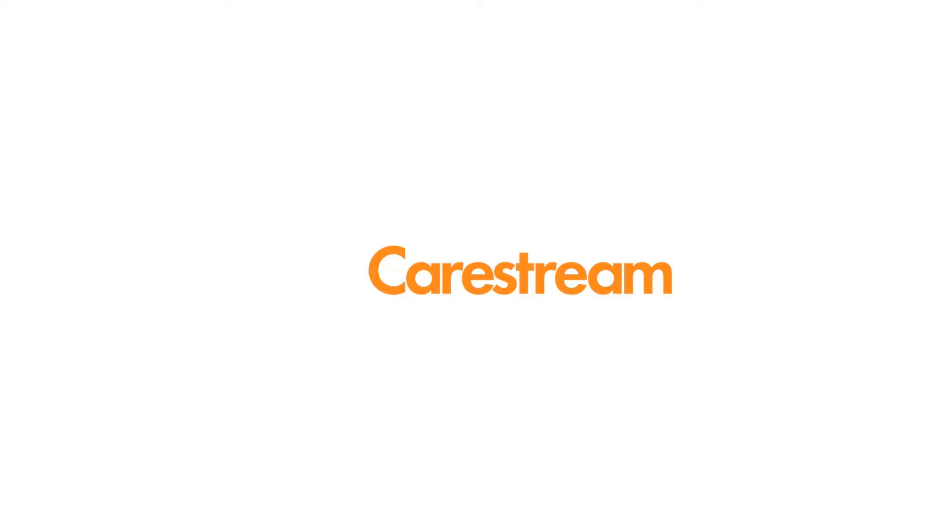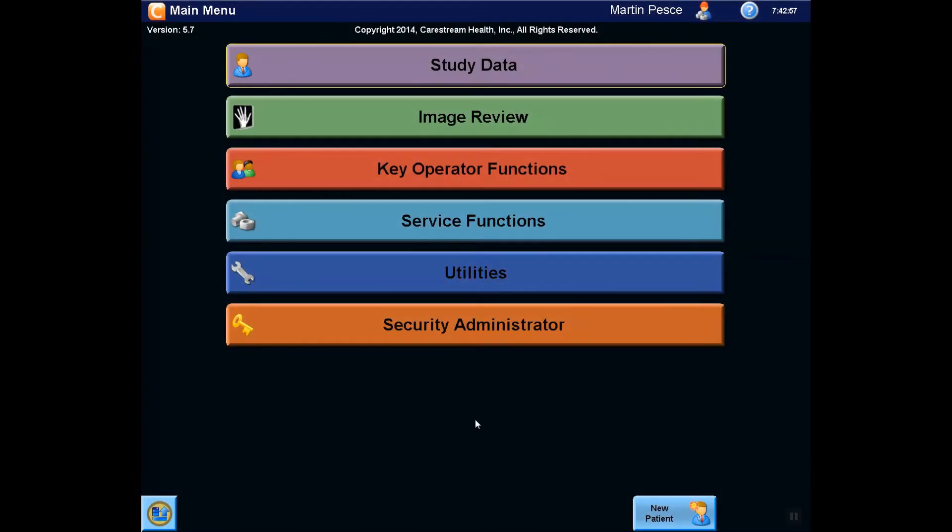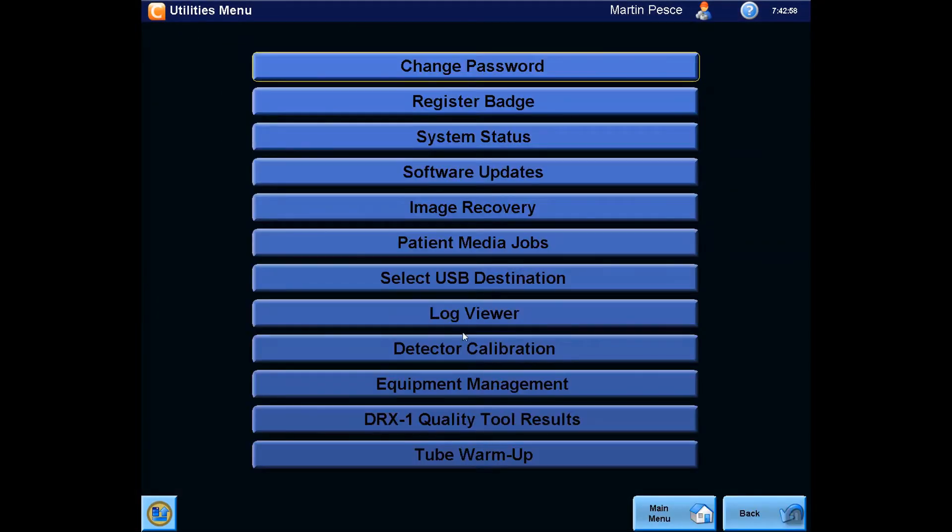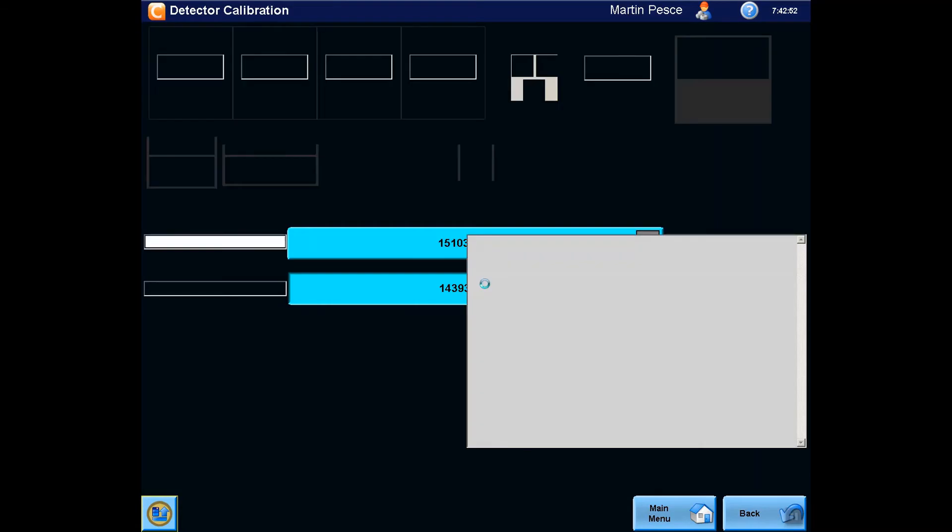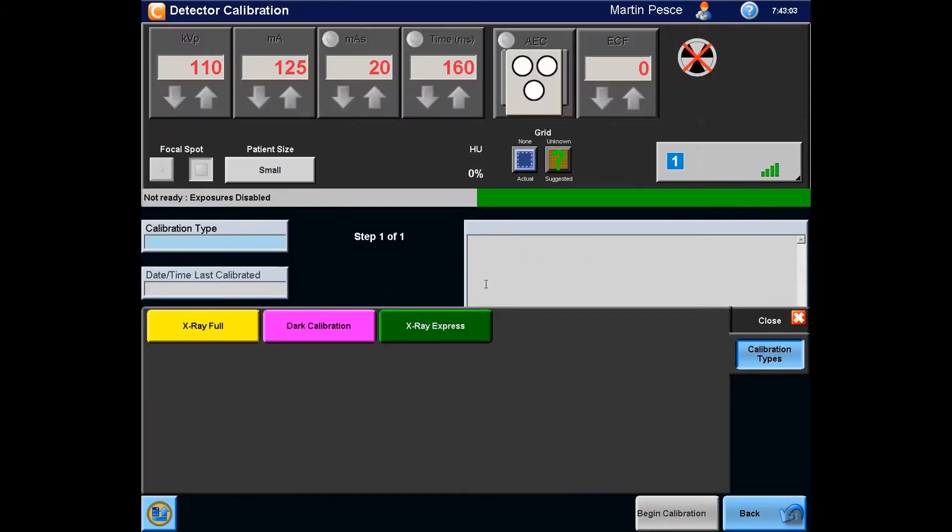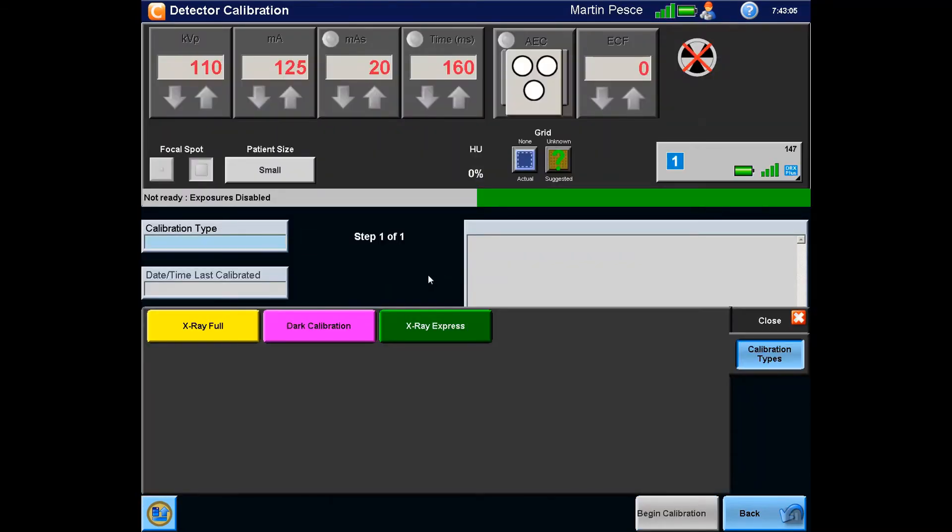This video will demonstrate the process to perform a full calibration on the DRX Plus detector. From the main menu, select the Utilities button, Detector Calibration, and then select the detector you wish to calibrate. Select X-ray Full from the choices.